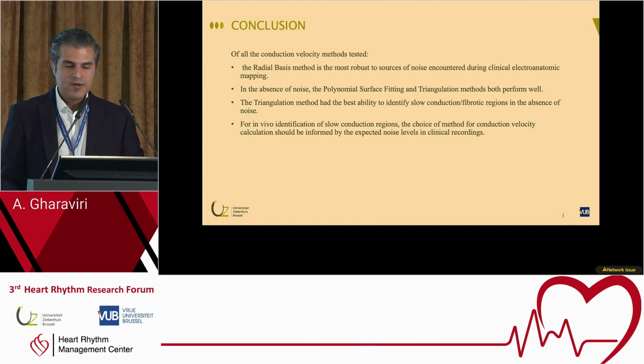In the absence of the noise, all algorithms work perfectly. So if we want to select our algorithm, we have to be careful about what the noise level is and which algorithm we should pick. And the triangulation method had the best ability to identify slow conduction of fibrotic lesions in the absence of the noise.